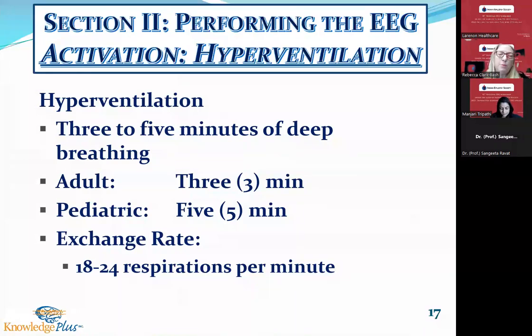That may cause patients with anxiety to get very amped up, get very nervous that they're going to go into an uncontrolled hyperventilation. So I call it the deep breathing exercise. And during that time, it's important to tell your patients their fingers and toes might get numb and tingly. It's important to tell the patient that they might get dizzy. That those are all normal steps.